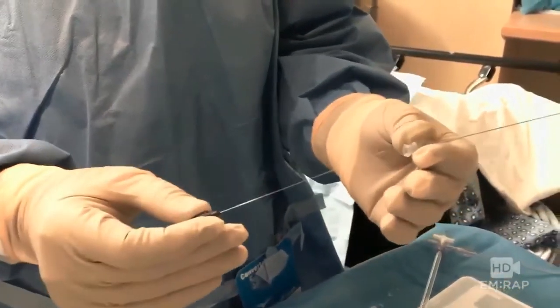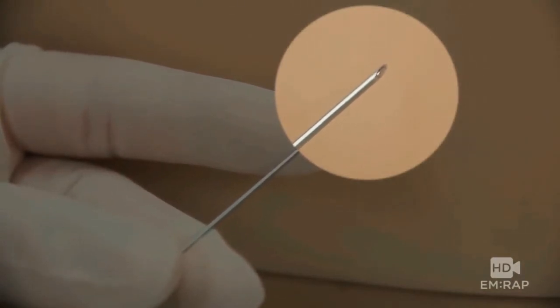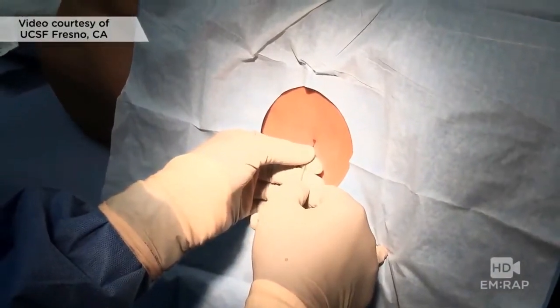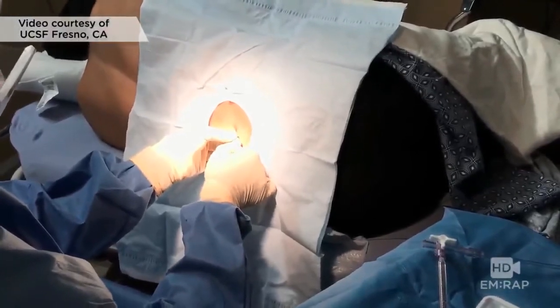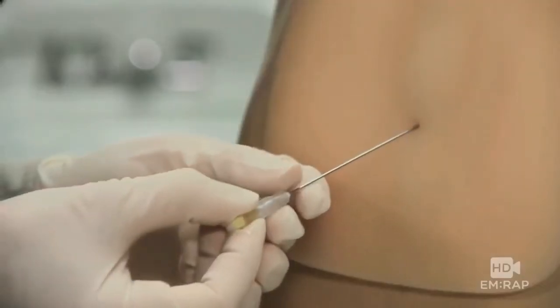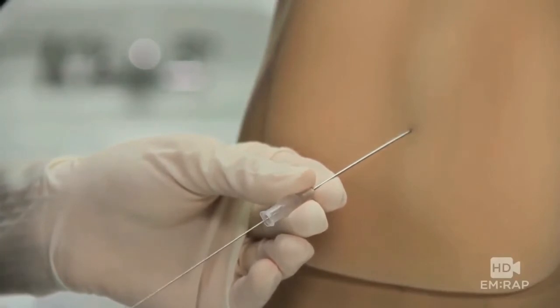Spinal needles come with a stylet in place. The bevel should be oriented longitudinally with the dural fibers — so if the patient is lateral, the bevel is up, and if the patient is upright, the bevel is to the side. Try to stay midline and imagine you're aiming right towards the umbilicus — the belly button. Your needle has to penetrate the supraspinous ligament and the ligamentum flavum, so in theory two pops. In an average size patient, that needle is going to be inserted about three-quarters of the way. As you advance the needle, check frequently for spinal fluid because you won't always feel that pop through the ligaments. Remove the stylet and check for spinal fluid, then advance it a little further.